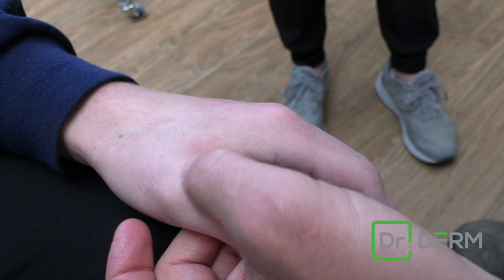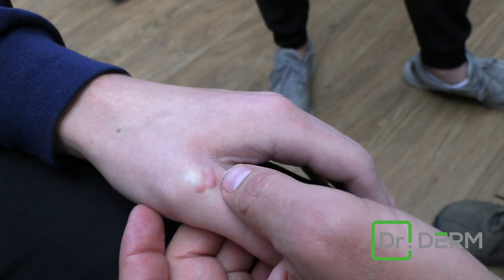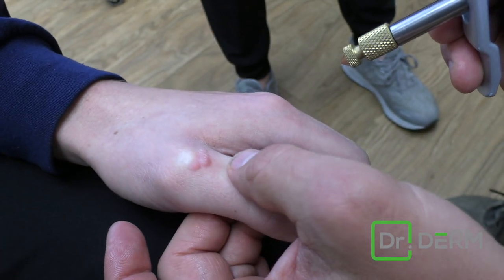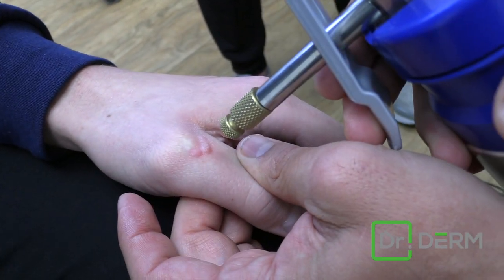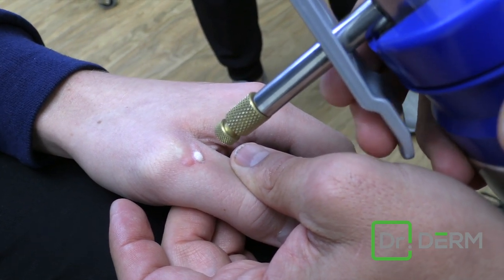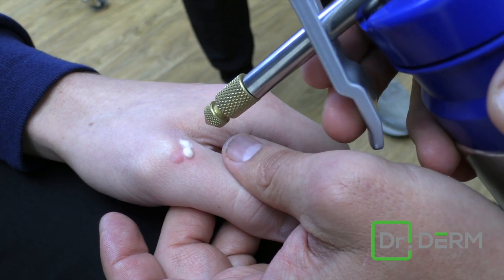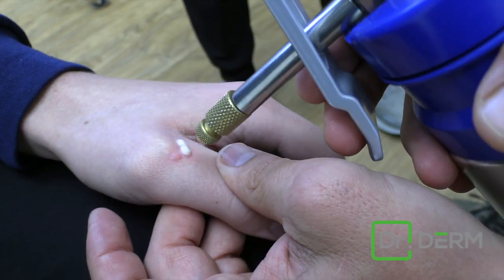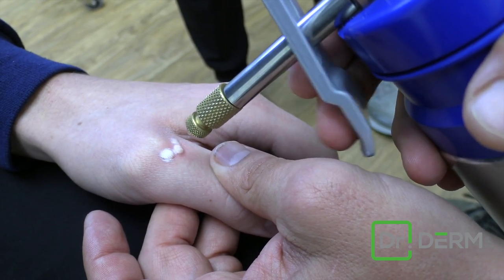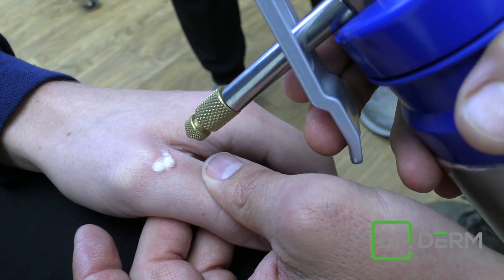It's already been frozen before — all of it has been frozen multiple times. You can already see a little bit of freezing from before. So I want this ice ball to go deep, so I pulse it. If I just froze flatly, it would spread wide, but I want it to go deep. So most of the time I'm doing warts, I'm pulsing it so that the ice ball goes deep.